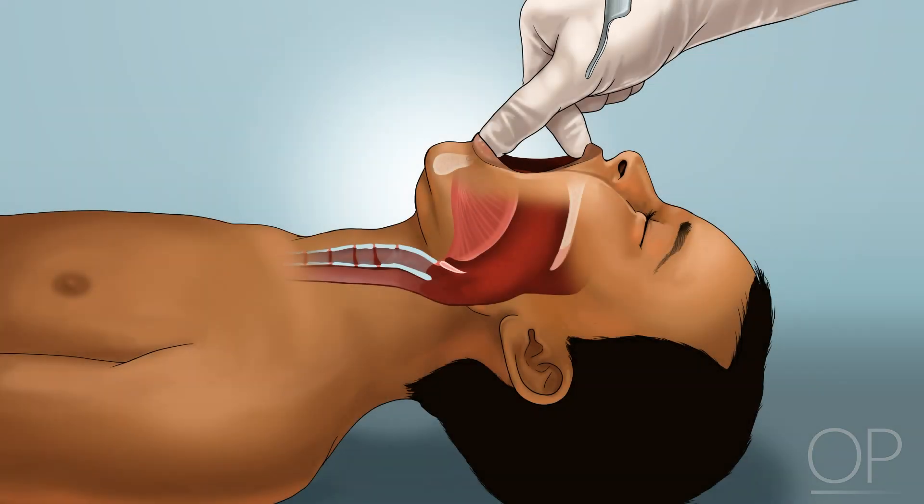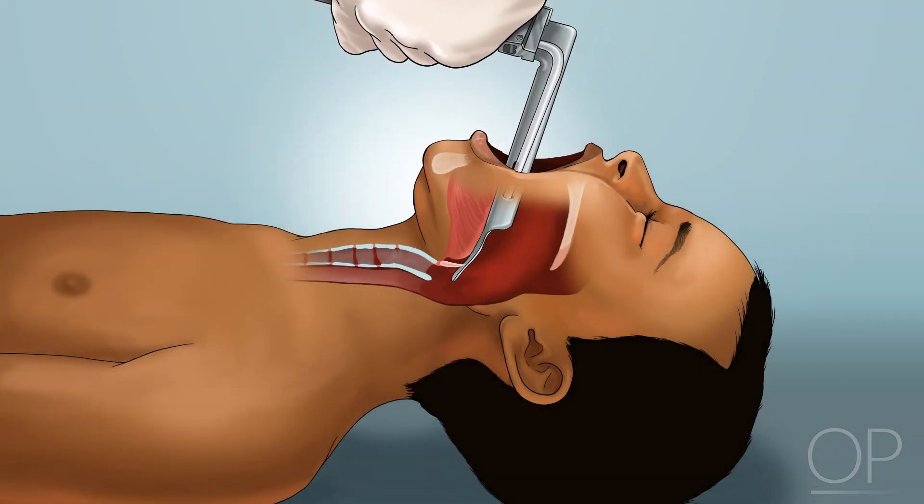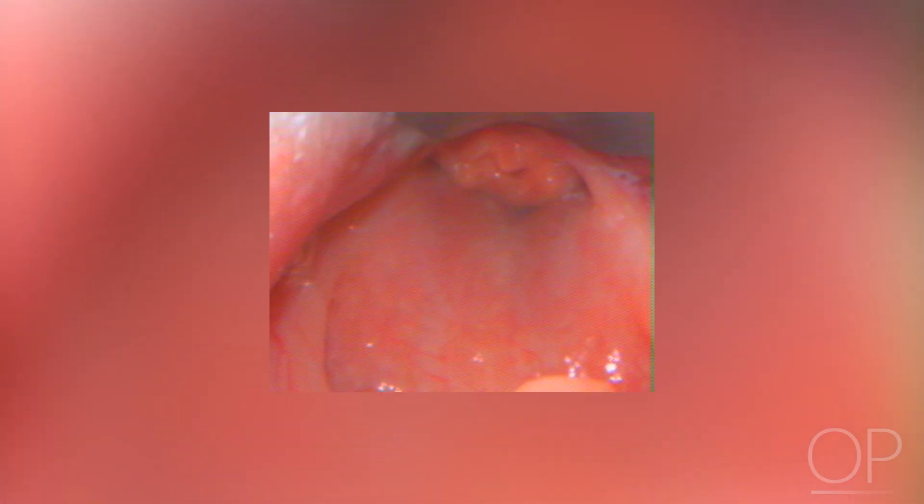Different techniques may be used with different laryngoscope blade types. The first option is to use a straight or Miller laryngoscope blade placed directly under the tip of the epiglottis and gently lift to compress the epiglottis against the base of the tongue to provide visualization of the glottic opening.